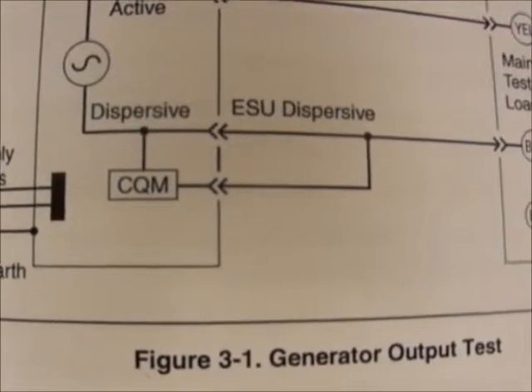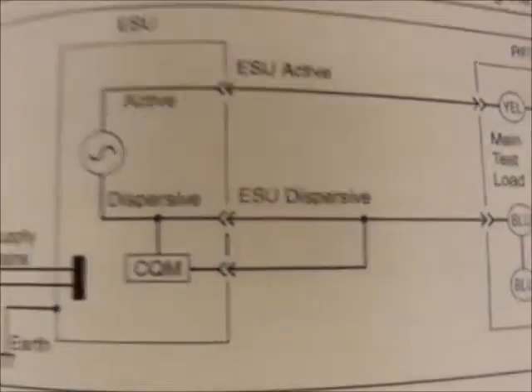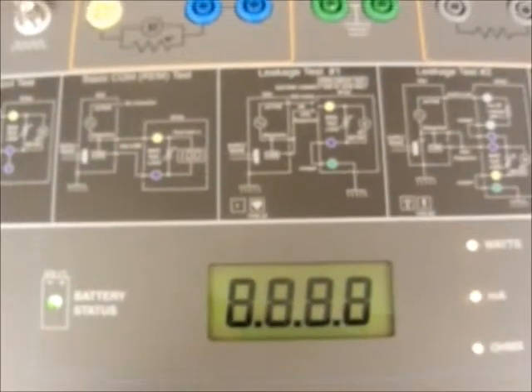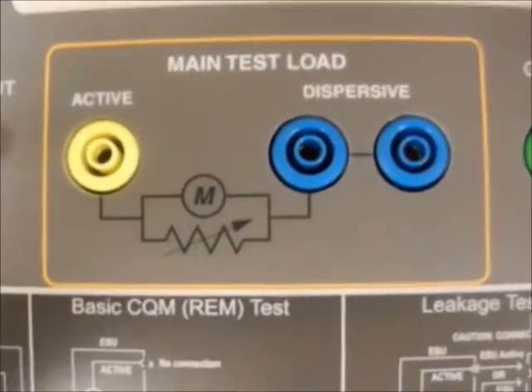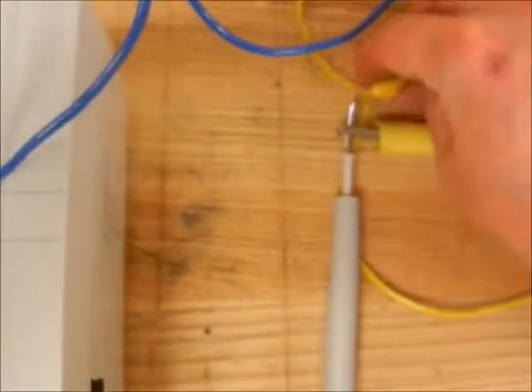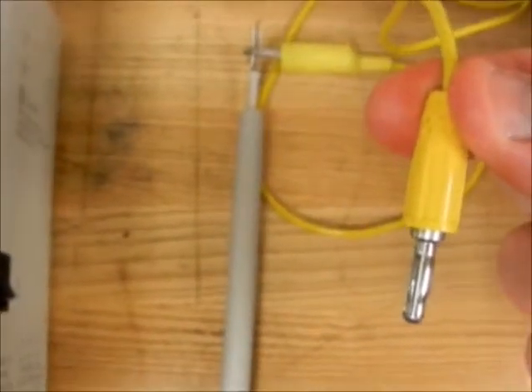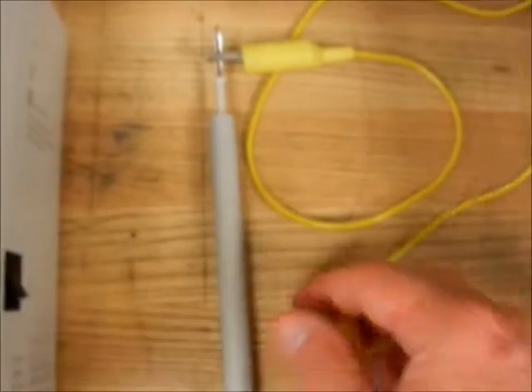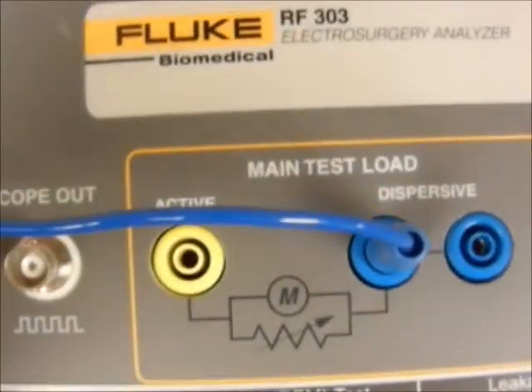Power output is measured in watts. So let's begin. First, we turn on the RF 303 electrosurgical analyzer and connect our inputs. We will connect the blue dispersive or patient plate electrode to the main test load dispersive port. We will then connect our active electrode, or pin electrode, to our active port.